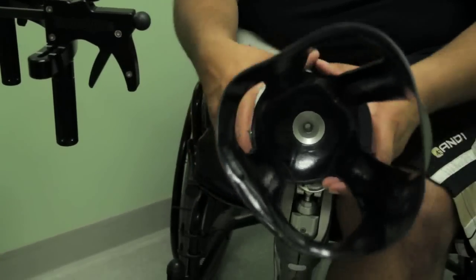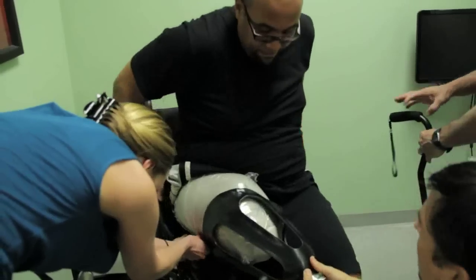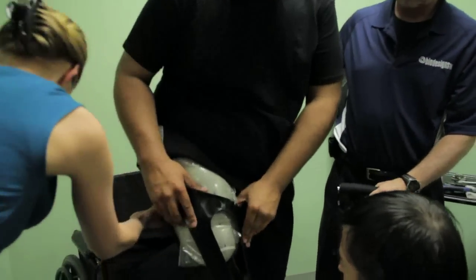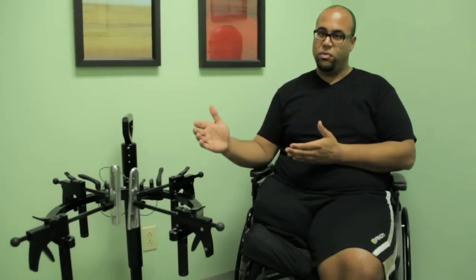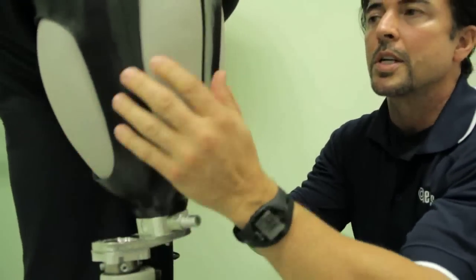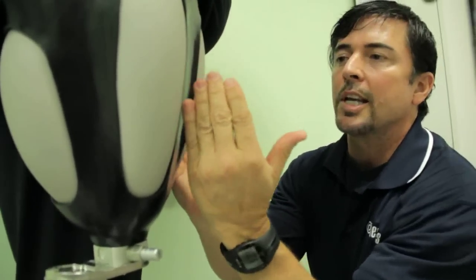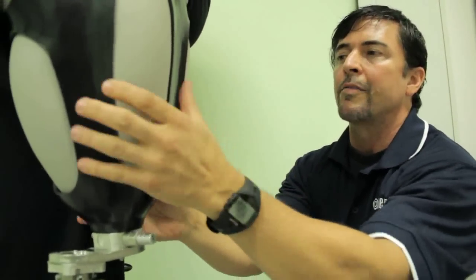There really hasn't been much advancement in sockets. You can either do the lanyard that straps from the outside, or a pin that clips in, or a suction bag, or vacuum — all great systems. But it's all that same bucket type socket where your leg is just in the bucket. So this is the first time I've really seen something different from that. You can see the tissue bulging out of the interface from various angles, and this allows us to get in closer to where the bone is inside and lock it in place, as opposed to allowing it to move back and forth.